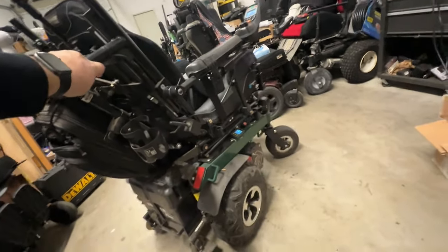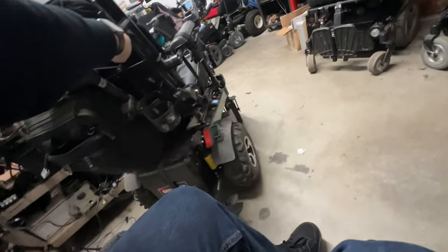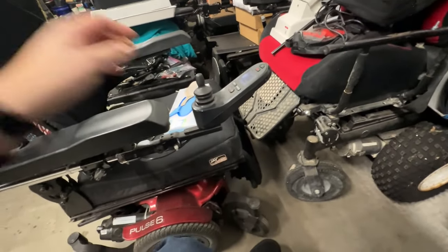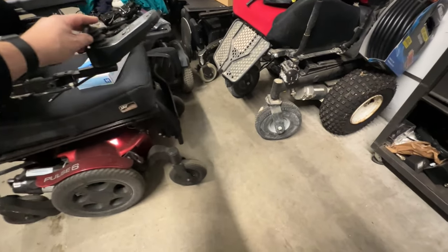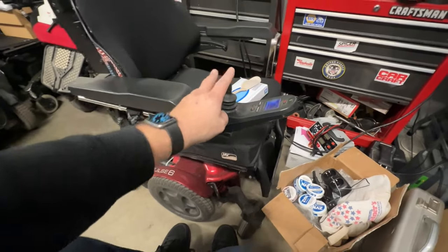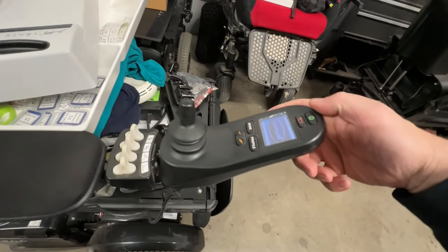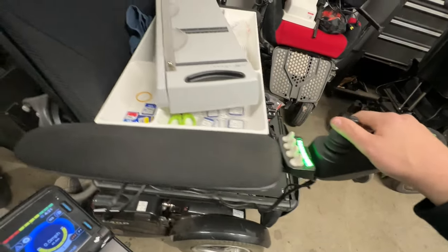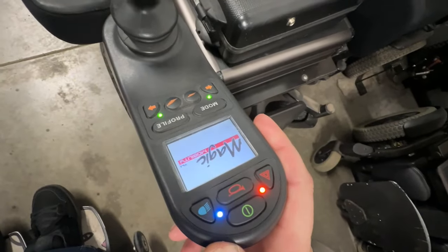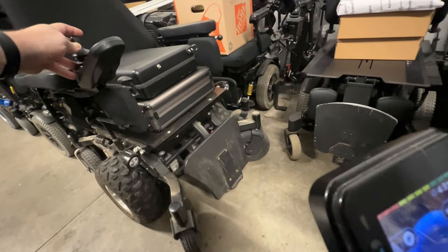There's stuff behind me. Then we have the old Pulse 6 here, also known as the Salsa in some other countries. It's an okay chair and simultaneously pretty terrible — these things have issues with bolts and stuff literally falling off. I was moving it in here a couple days ago and some random bits fell off the suspension. Let's see if the C300 will power up — looks like I left the batteries connected. I don't think I've charged this thing in a few months so we might not go super far in it.